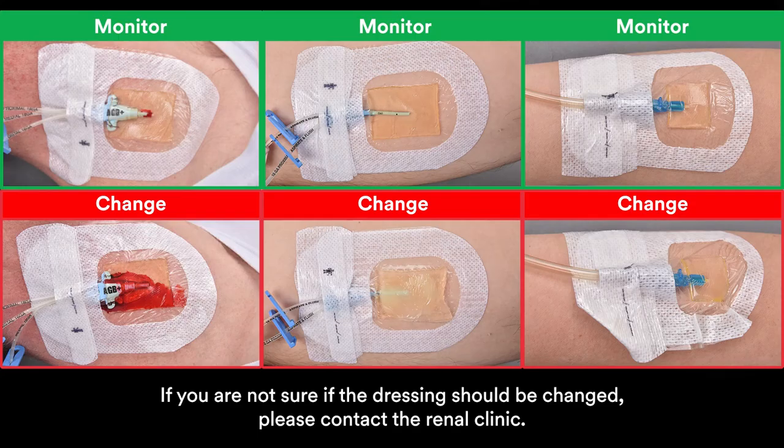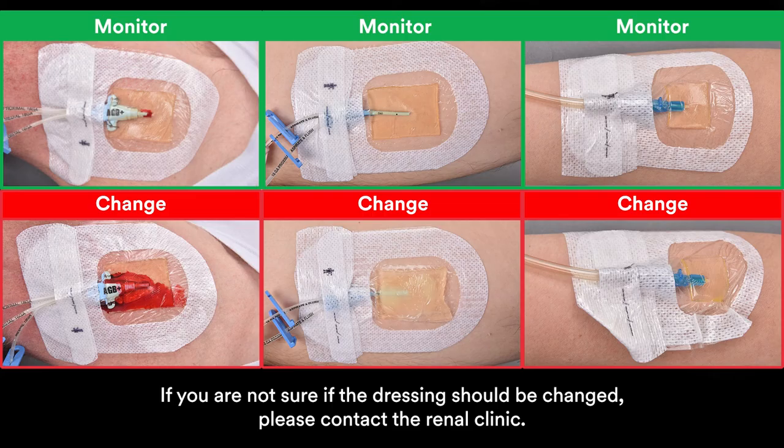If you are not sure if the dressing should be changed, please contact the renal clinic. This concludes the demonstration for 3M Tegaderm CHG, Chlorhexidine Gluconate, IV Securement Dressing 1657R for peritoneal dialysis.